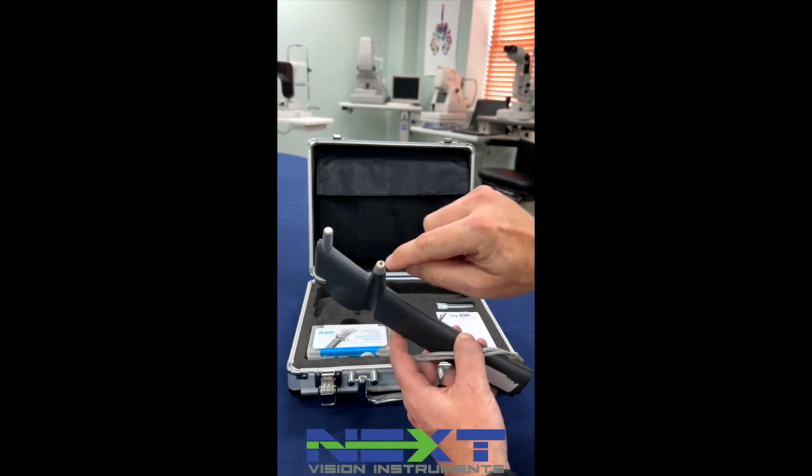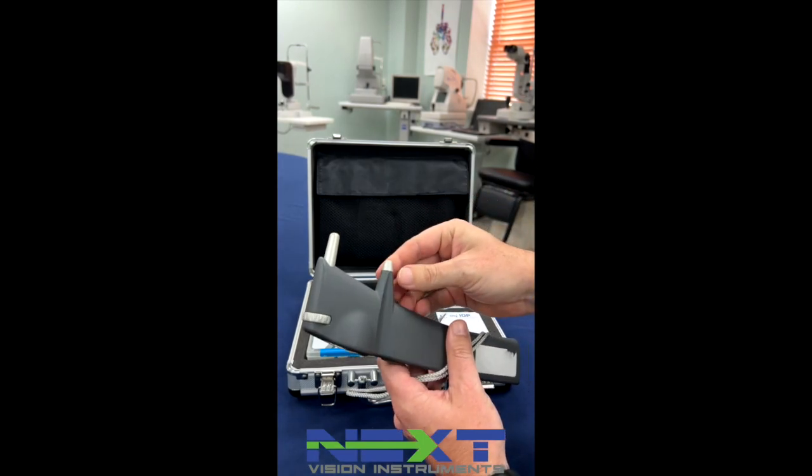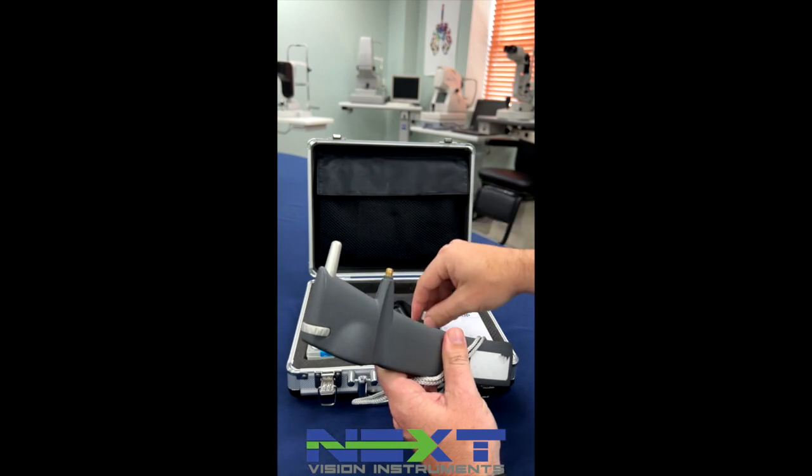The probe goes here — your disposable probe. Sometimes you need to change the base. They recommend once a year; it gets dirty and gunked up.